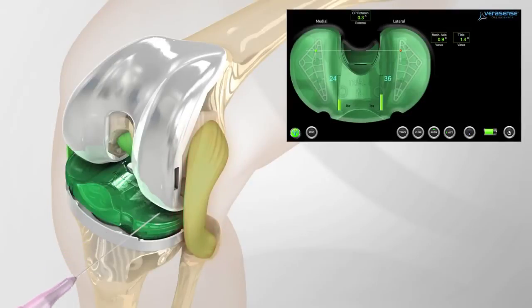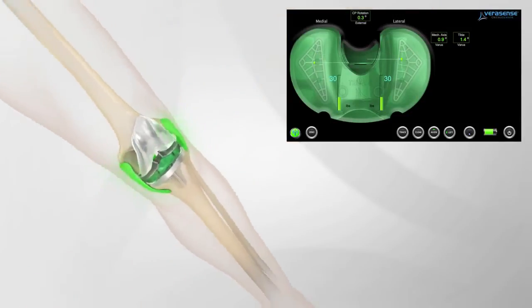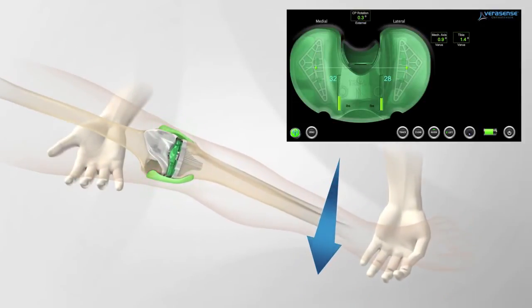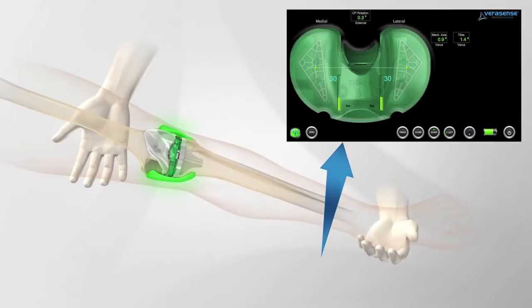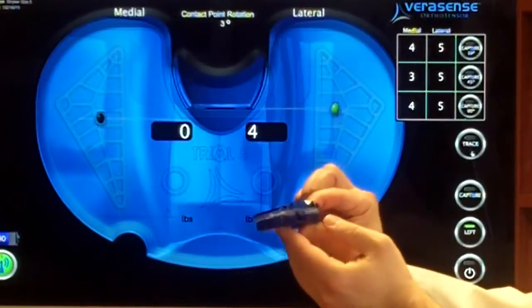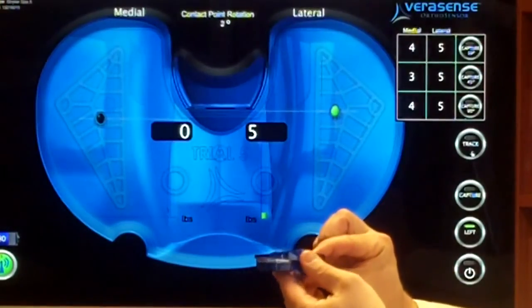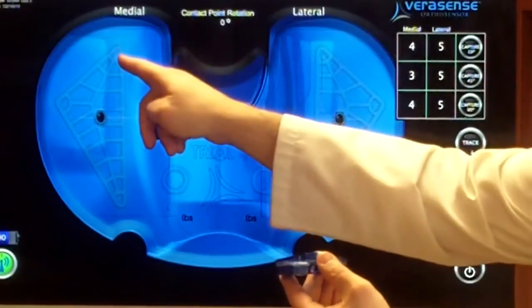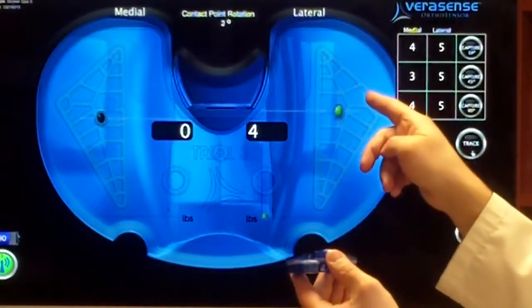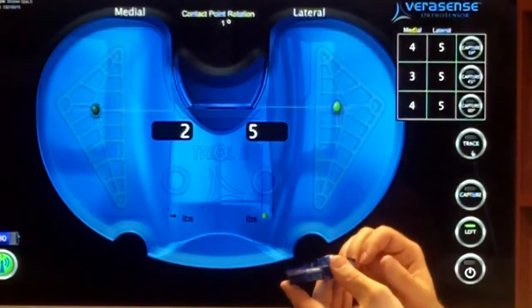So this smart technology lets us make sure that the knee is put in with the proper balancing, so the knee comes out with the best chance of having a perfect range of motion. The way this works is when the Orthosensor Verasense implant is placed into the knee joint for trialing purposes during the surgery, it's going to sense the amount of pressure on the medial side, that's the inside of the knee, and the lateral side, with the knee in various points in range of motion.